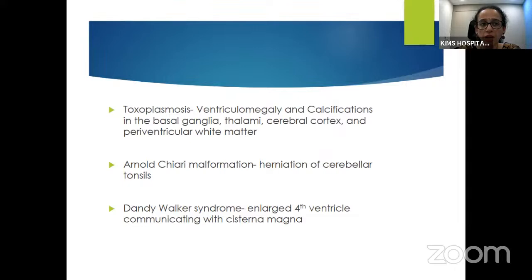So these are some of the things which can be diagnosed by neonatal cranial ultrasound, mainly useful for preterm babies, and in term babies or any sick baby in the NICU, where you can diagnose some specific conditions, provided you have prior knowledge of the anatomy and age-related maturational changes, and you should also correlate them with the clinical signs and then diagnose appropriately.